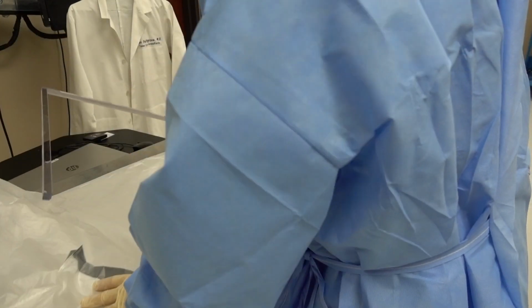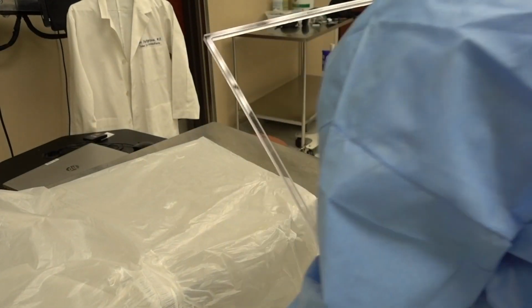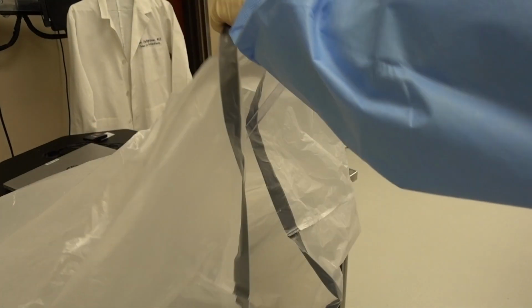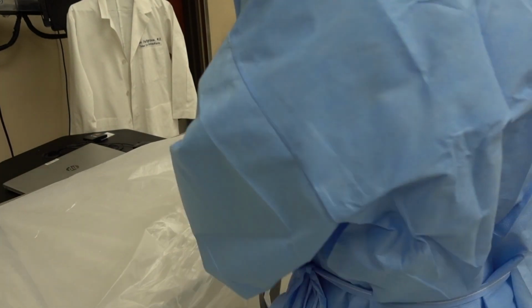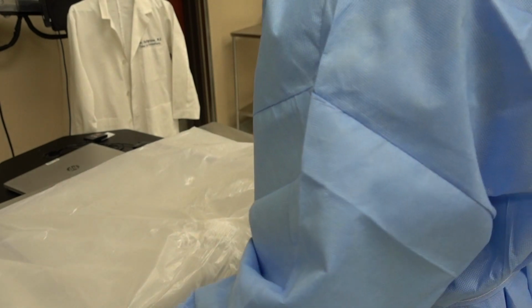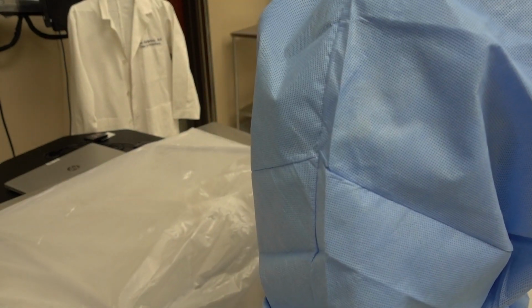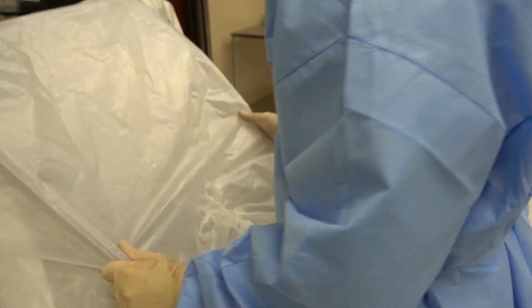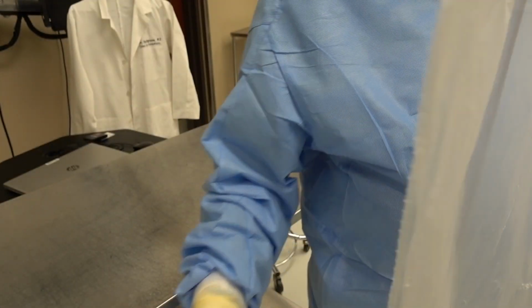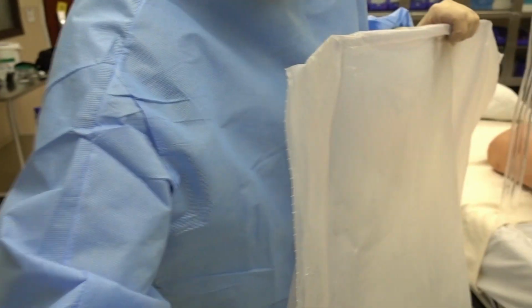This bag has been used a million times. But to place it, you just place it right in the middle. We're trying to save supplies here, so we're using everything over and over to demonstrate this. And this has punched holes in the bottom, but you'd use this single use, of course, on a patient. But that's just placed in the middle, and again, it's placed through into the ring just like the other one was. So we'll show you that real quick.